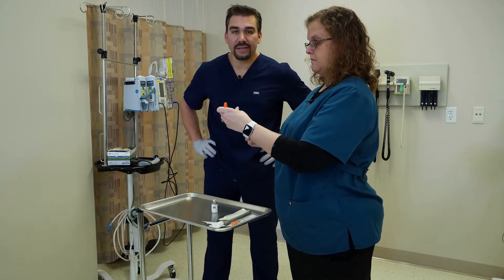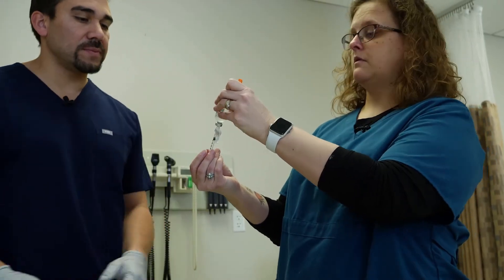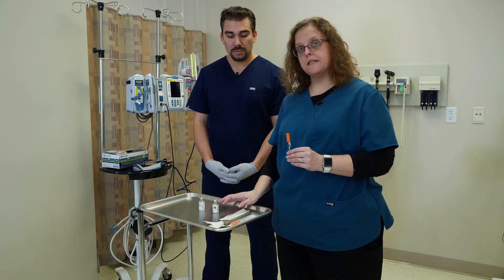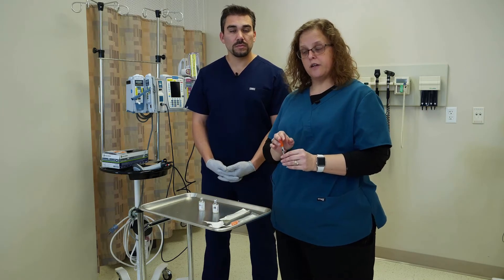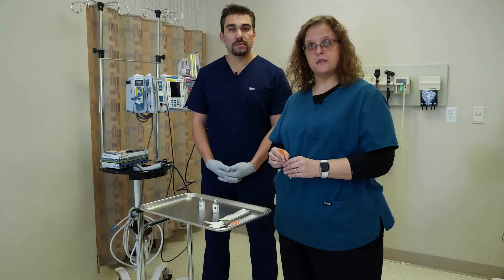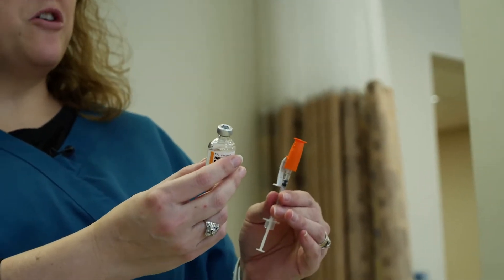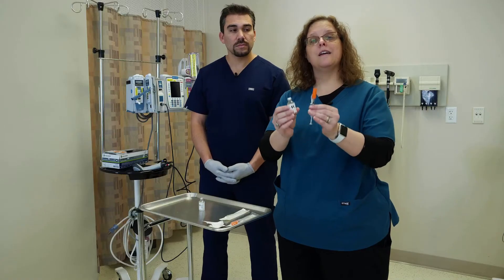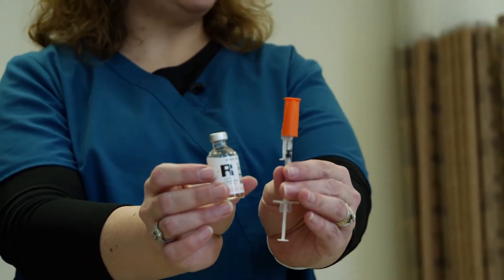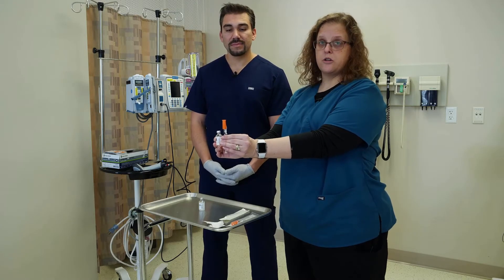It's a little side note: we always need two nurses to verify an insulin draw like this. You want somebody who's looking at the order and has actually seen you draw up — yes, you have five units of regular insulin, and they saw you draw up your NPH — yes, five units of NPH. Better yet, walk up to the other nurse and say, 'Tell me what you see,' so they don't just have the option to say 'yep' and move on. That way you've actually gotten a valid double check.